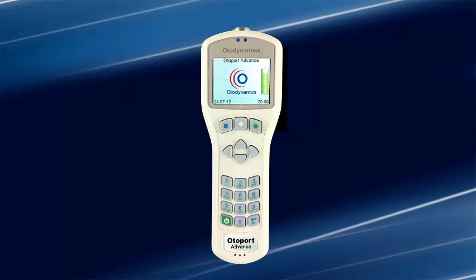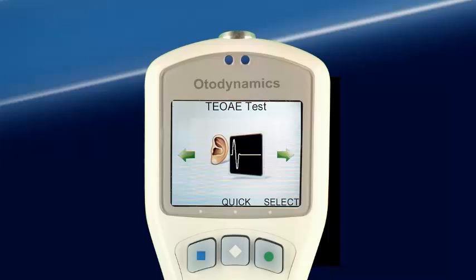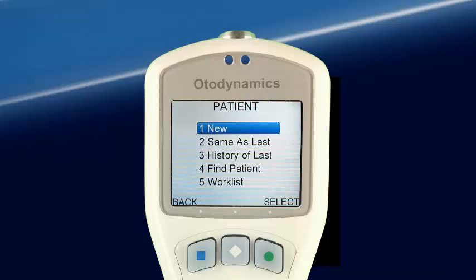This test protocol uses a click stimulus of 84 dB peak equivalent SPL. The TE-OAE test screen provides two options: Quick and Select. Quick runs the TE-OAE test followed by the entry of the patient details, providing for immediate testing. These are the most common choices.